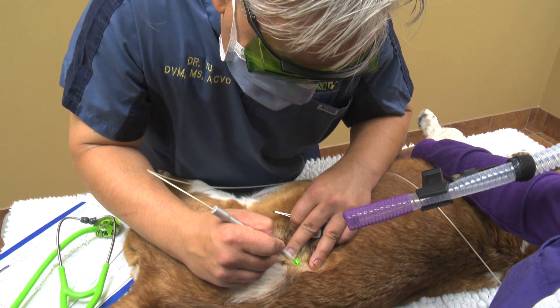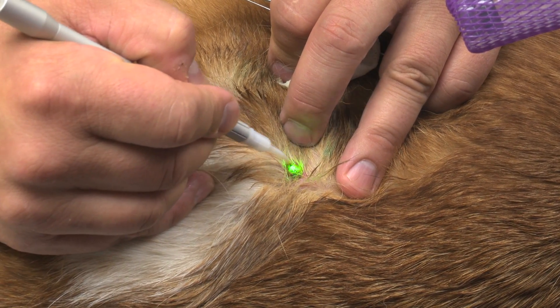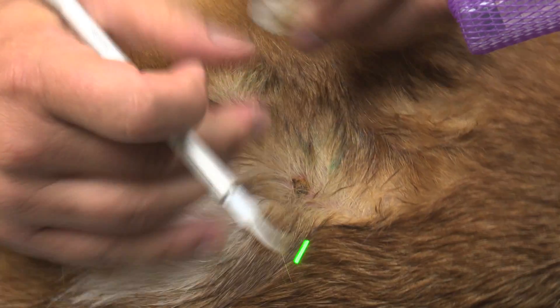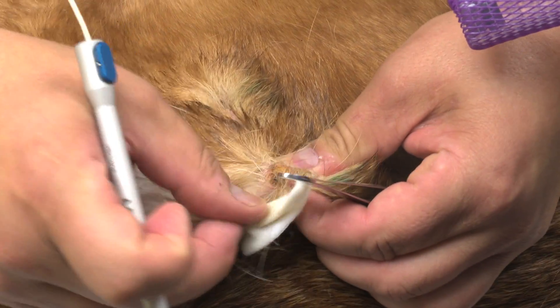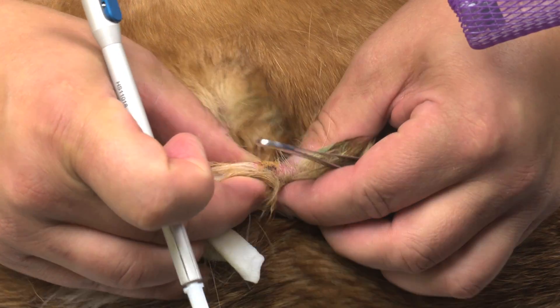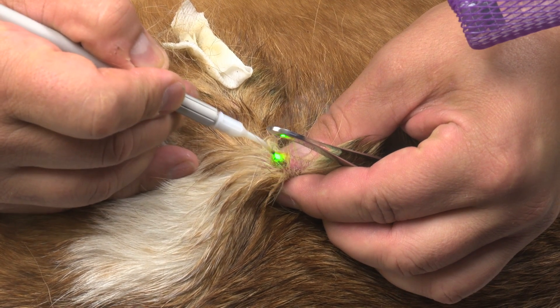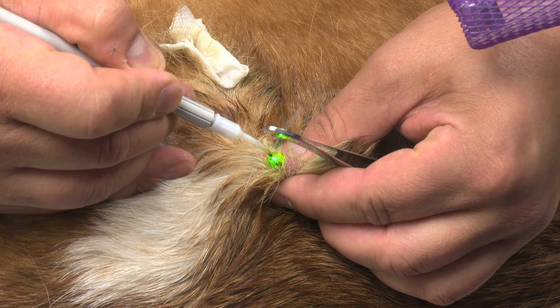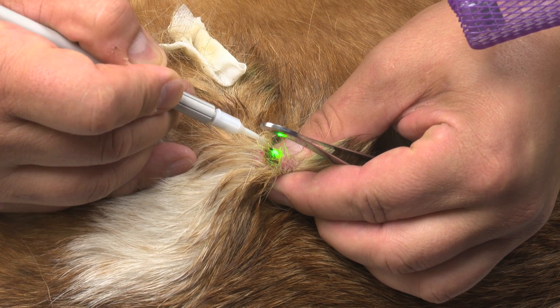I'm doing a bit of a hash pattern to make sure I cover the whole surface area of the affected lesion. When do you stop? Pick up the tissue between your fingers and look for some healthy tissue underneath.